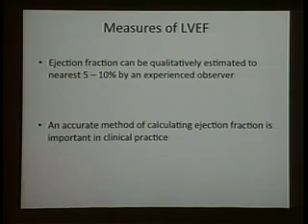It's kind of funny, I do this exercise with my residents. When they give you an echo report, you will see that they will measure some of this information, and they'll give you a number by, I don't know, Teichholz's method. I'm going to show you in a minute how that's done. Then at the end, because the funny thing is, when you residents look at an echo report, what's the first thing that you do?